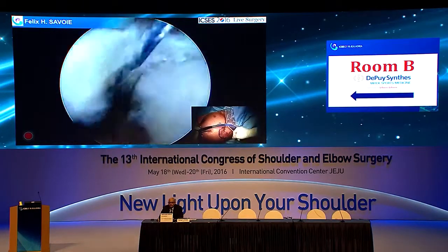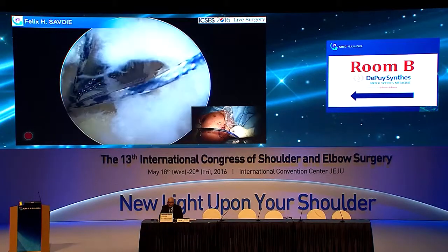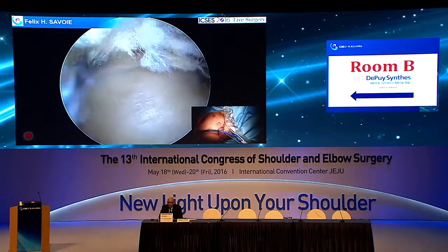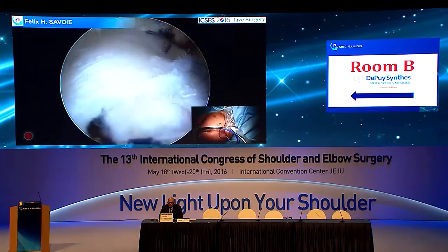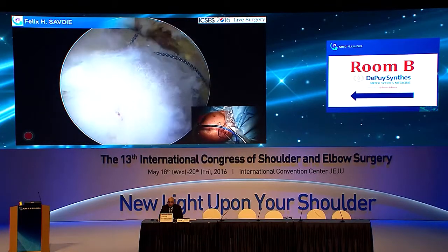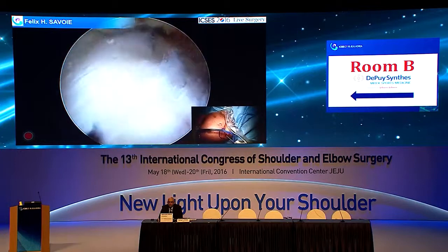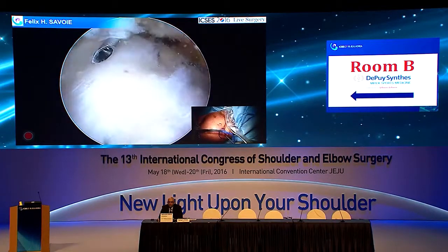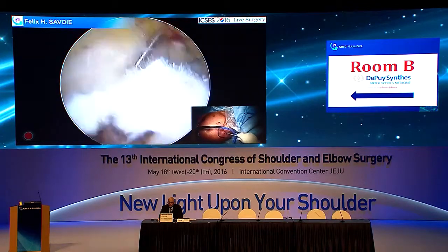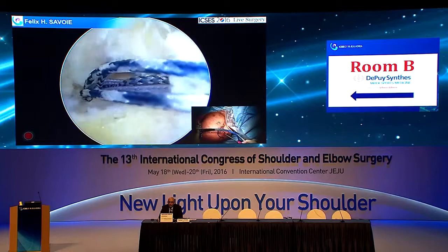You see I changed portals where I was retrieving from? Did you see that? I think I missed that. So I'm coming in from the top now. Yeah, we can see that there. And even without taking out the AC joint, I can still come over. Now, as I move more forward, I've got to move a little bit more lateral. So we're going to come back over here because there's no delamination here, and I want to be a little cautious, but I still want to be medial to my undersurface part of my tear.